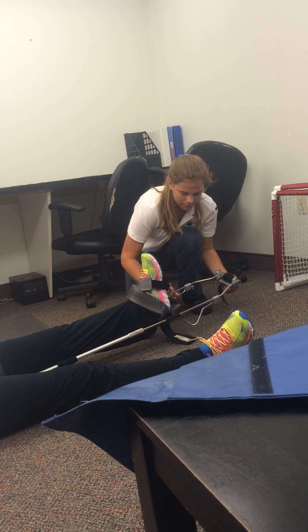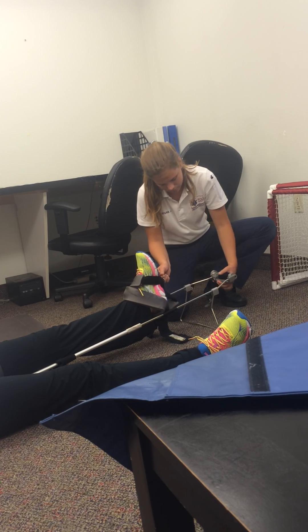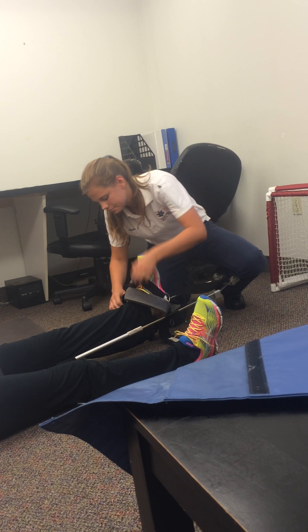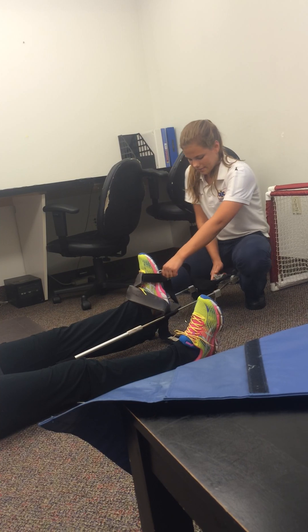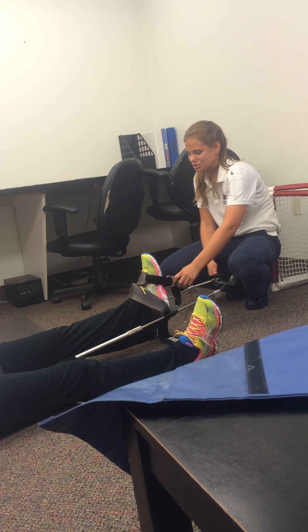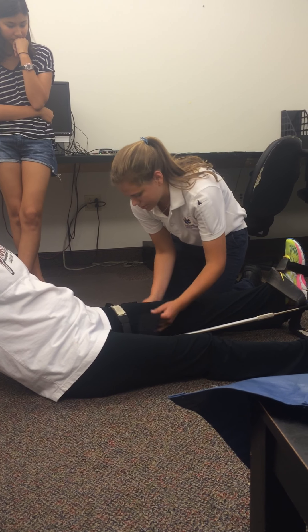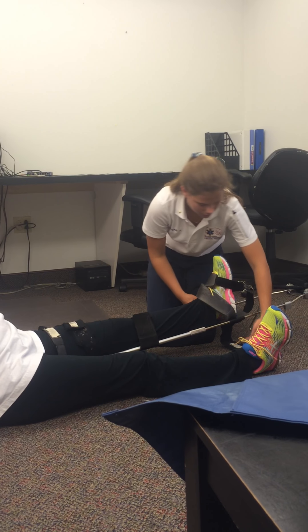Lift this up and have a partner help you put down the bar, then hook everything up. You pull this out to release it if it's already tightened, then put the hook through the three loops and tighten it — basically until the patient stops screaming. That's how we gauge it, because they'll feel great pressure. Once you hear them stop screaming, the bones are realigned. Then apply the remaining straps, making sure not to place any strap directly over the injury or over any joints. You can apply about three straps; one can go right over the ankle hitch.